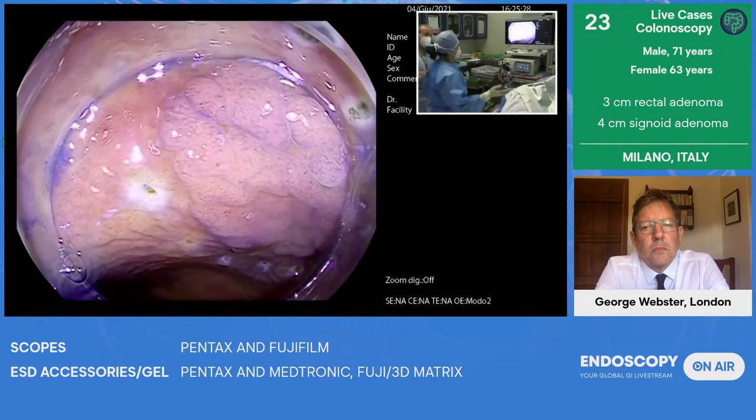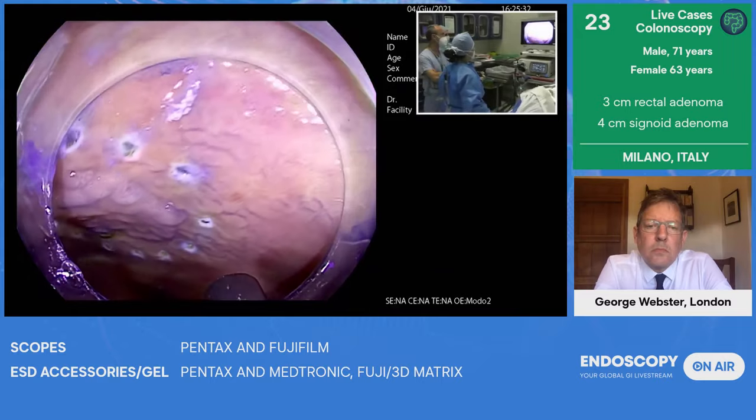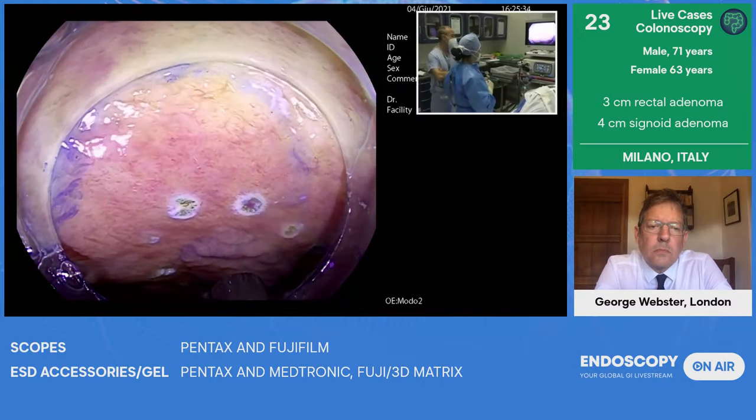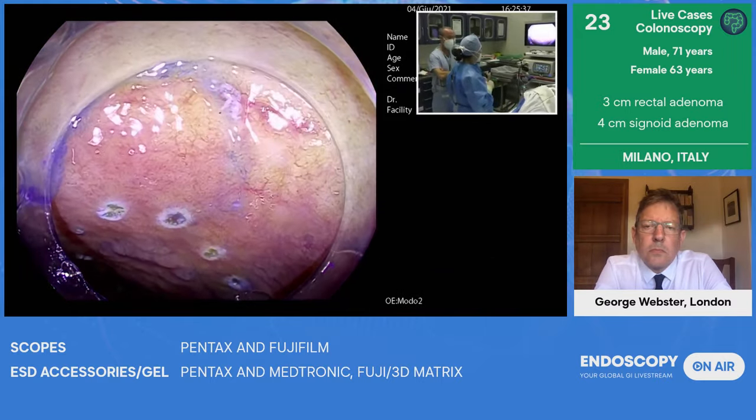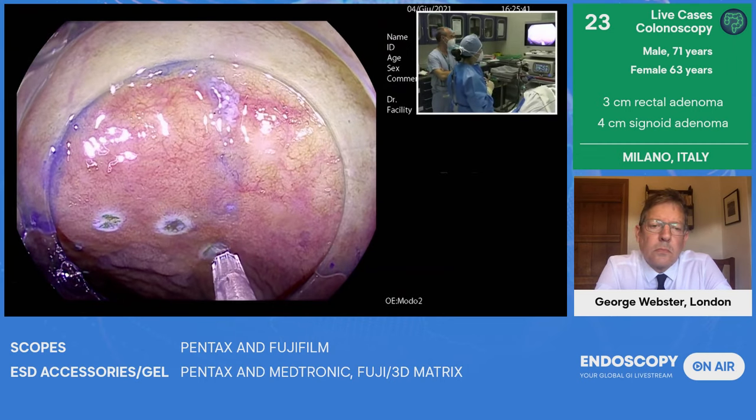Yep. So how will you resect? This is ESD, EMR? I'm going to show you the CAPS snare, which is a hybrid snare. The snare from Pentax. First, let me just inject. Okay, good. Needle out. Go.